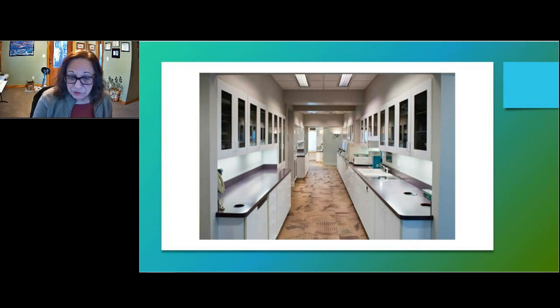All I'll say is if you have this kind of setup where a dental lab is on one side and you're on the other, you cannot be processing instruments while they are grinding and making dust. That has to be coordinated, because while they're grinding and making dust, you cannot take a chance on it going through the air and getting onto your instruments, which are then placed in a sterilizer.